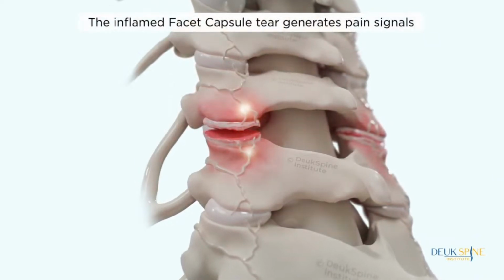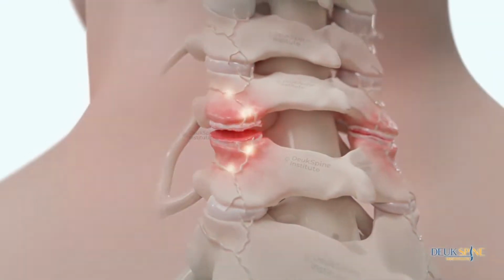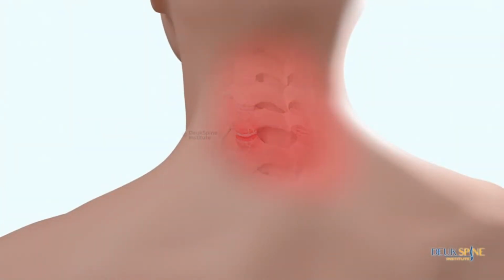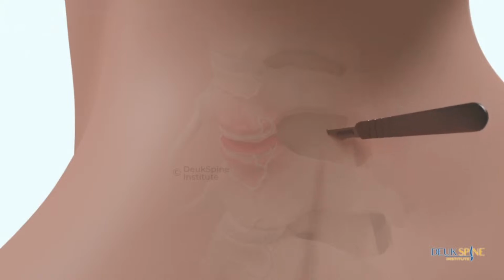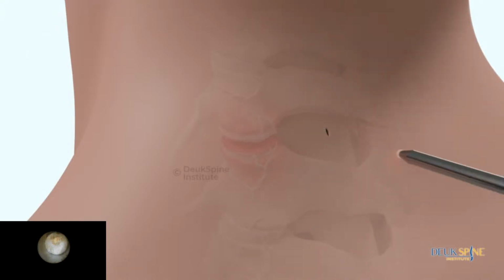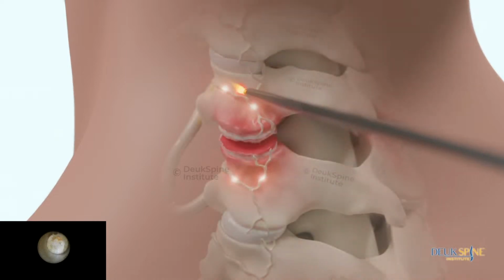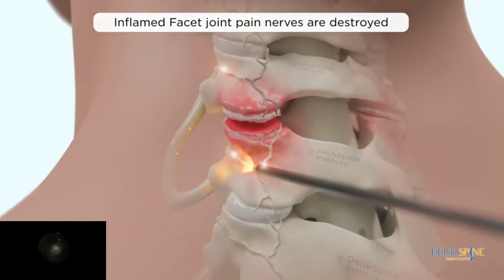The inflamed facet capsule tear generates pain signals. The best treatment for facet joint pain is the Deuk plasma rhizotomy. The inflamed facet joint pain nerves are destroyed.